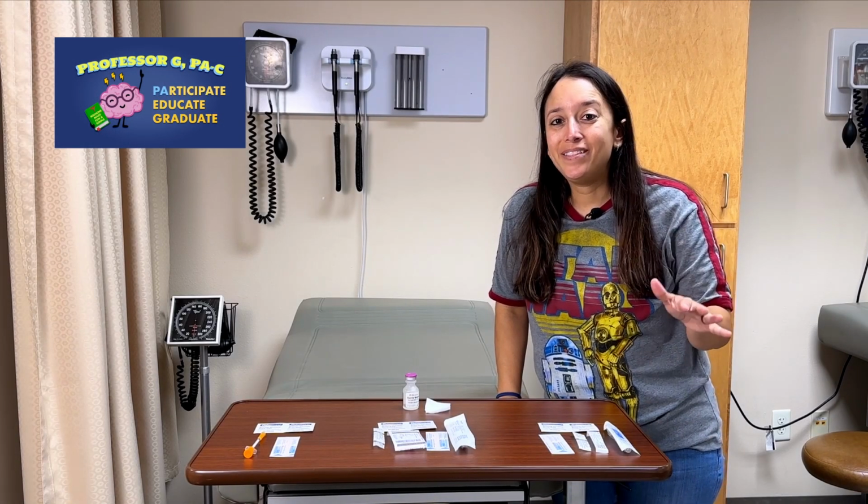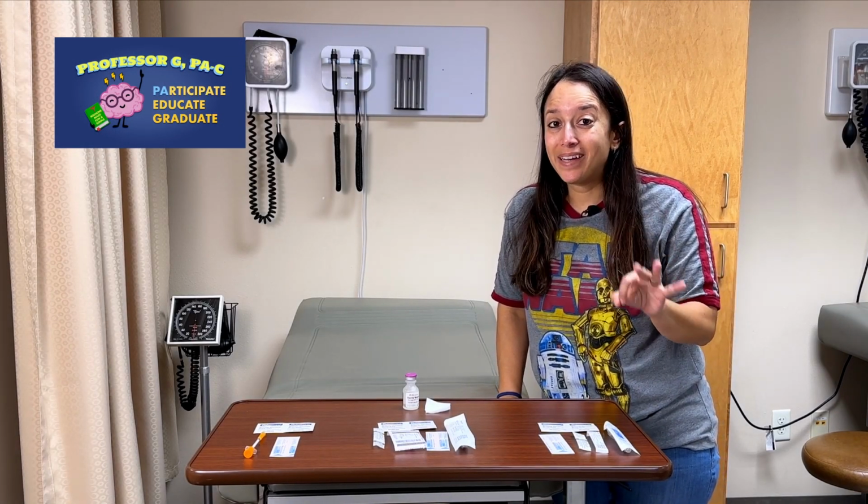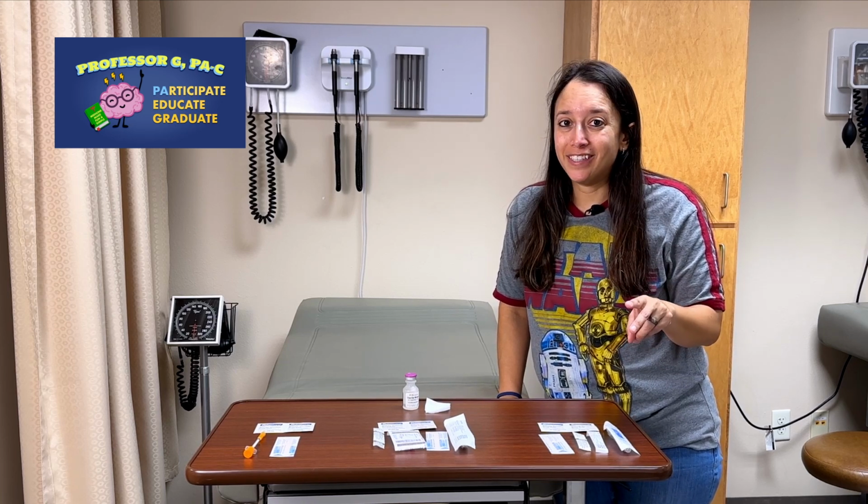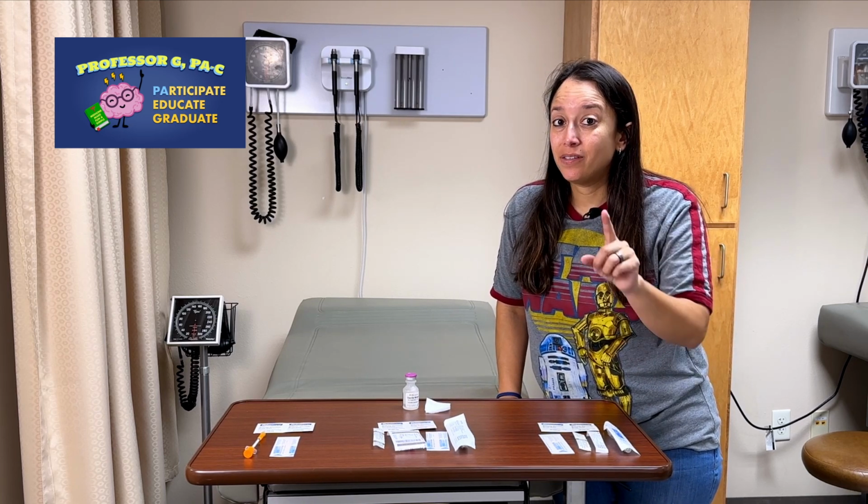Hey everyone, in this video I'm going to teach you how to do 3 different types of injections: a subcutaneous injection, an intradermal injection, and an intramuscular injection. So stay tuned.